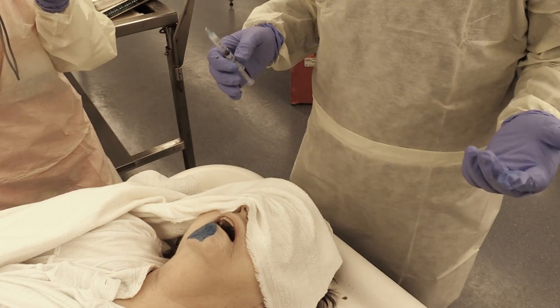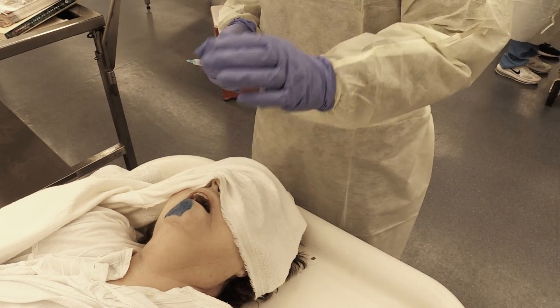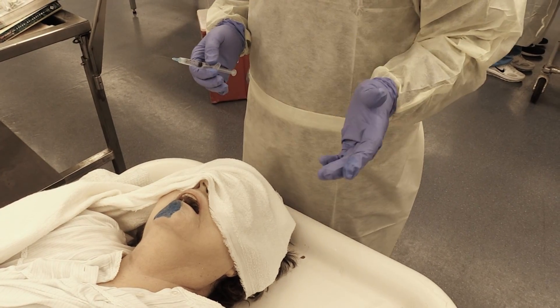Inject several milliliters, then wait for the anesthesia to take effect. After that, you can perform your laceration repairs or whatever other interventions you need to do.